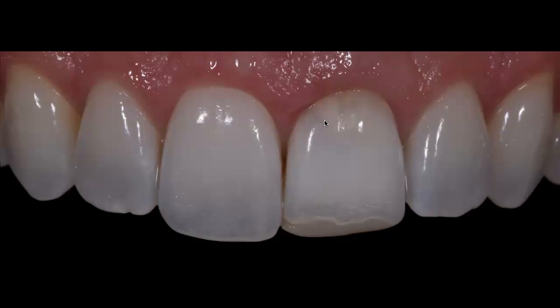She had a flap done there because there was a small perforation on the buccal root surface that they had to access, and then had to restore that area with a special biomaterial. J-Restore was actually what was used by the endodontist. The flap was done by the periodontist, but the actual repair of that perforation was done by the endodontist. So again, a lot of things done for this tooth.